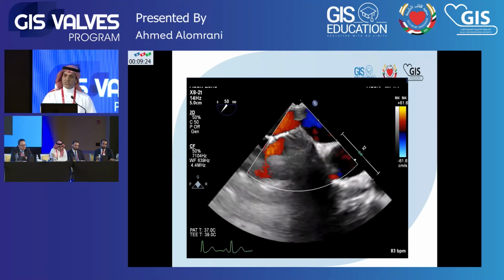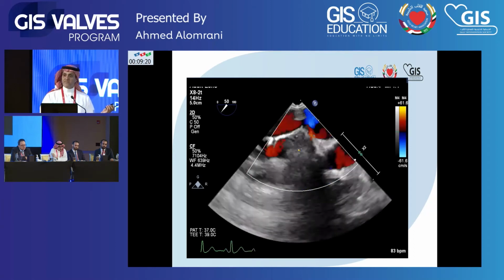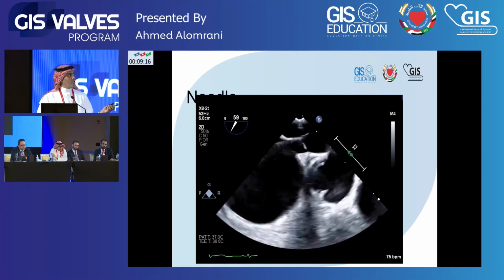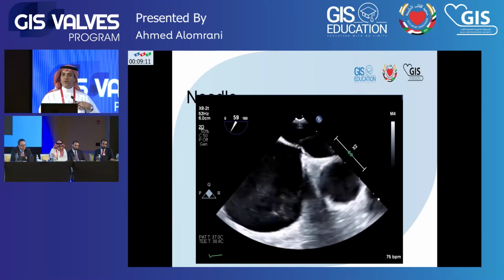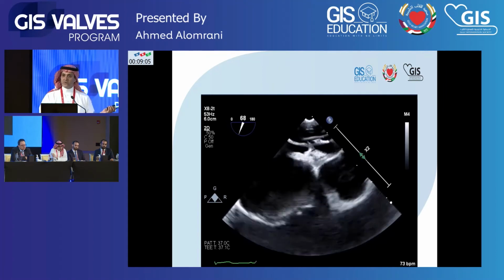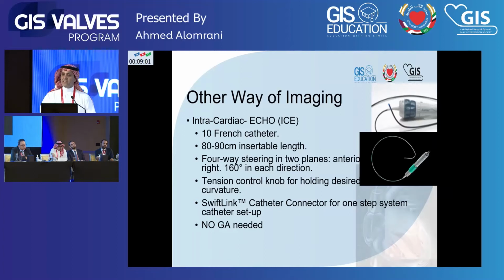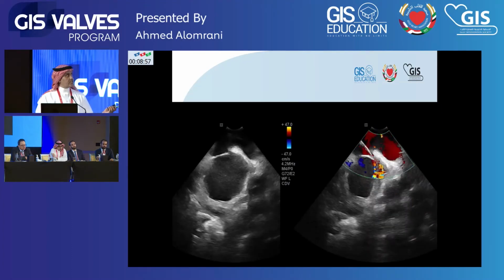That patient that I presented to you, the 39-year-old or 37-year-old, actually had a very difficult septum. Some of the challenges that we have, you can see how the septum is just probing it. I did not yet cross. You see the septum itself, the aneurysm reached almost all the way to the middle of the LA. Some of these techniques, you need to modify your process and go transseptal, and then you will be able to close it.